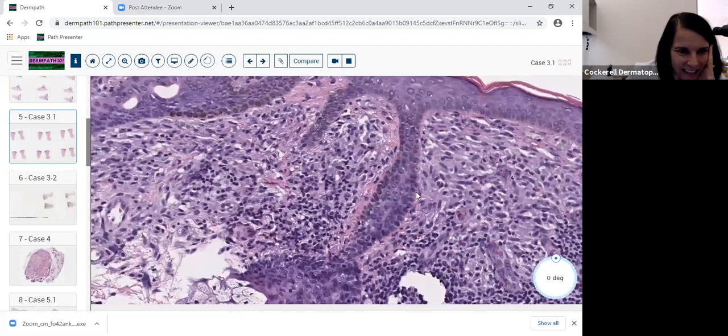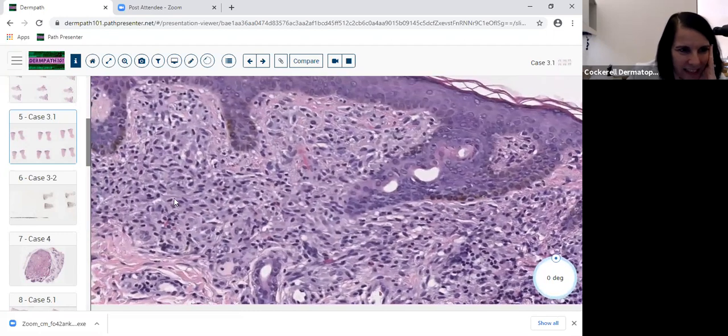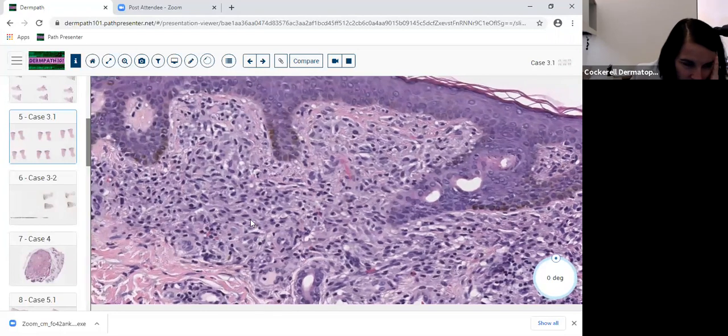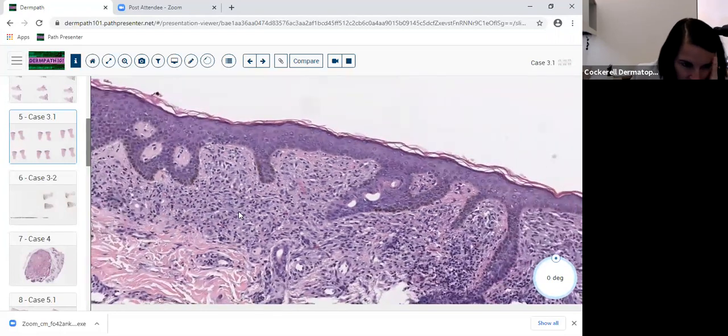You know, I'd like to stain this. I'm thinking maybe these are mast cells, because they have that spindled appearance. I might want to stain this because I'm not absolutely certain that these are mast cells, because they're sort of spindled. They look weird. And I haven't seen this many mast cells. There's thousands of cells here. There's over 250. So there's a pathology here. You shouldn't have this many mast cells in the dermis. There's over 250 mast cells per millimeter.